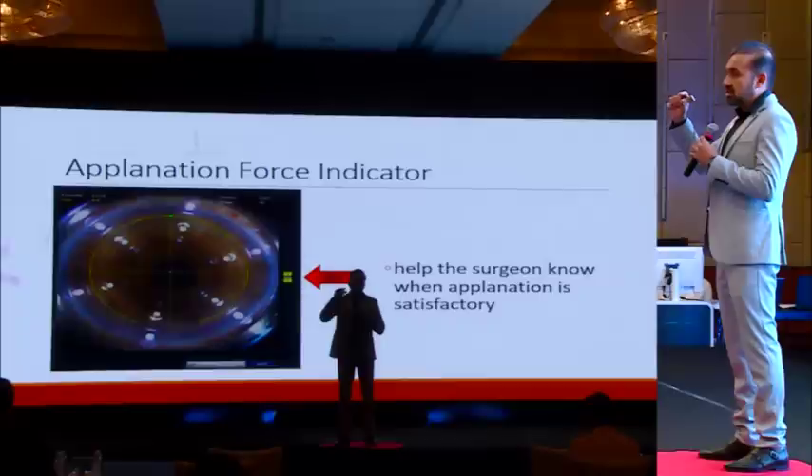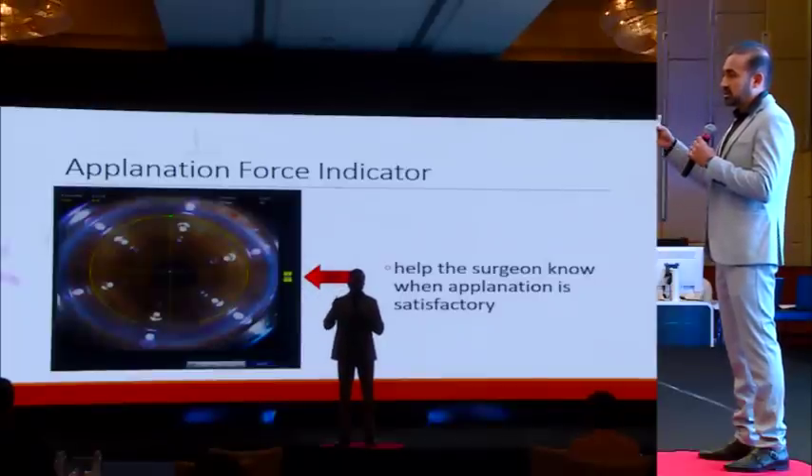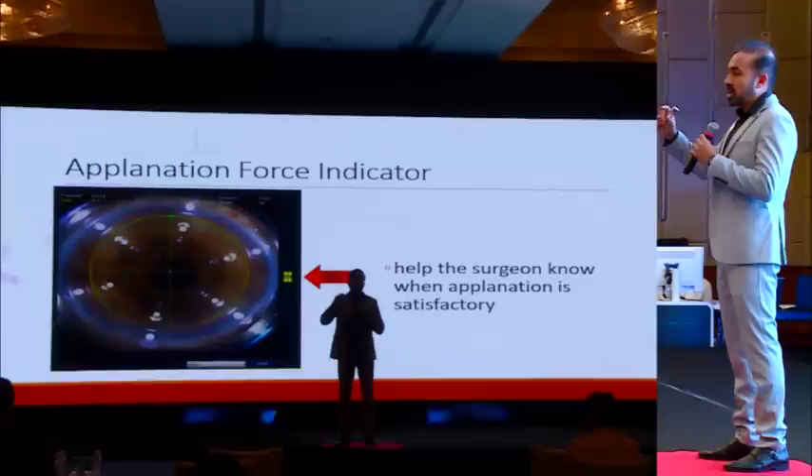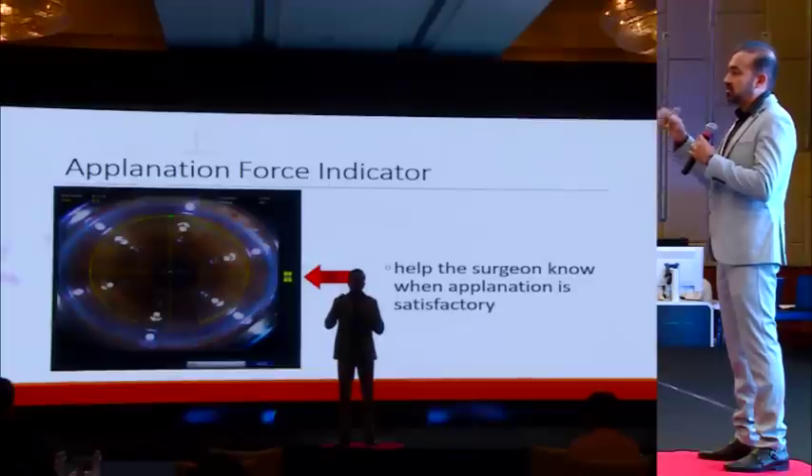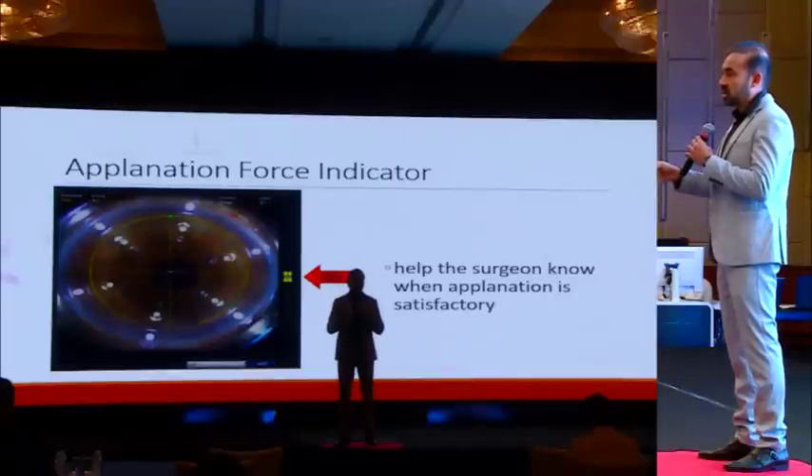On the right side of the screen is the applanation force indicator, which tells you that applanation is perfect. When it is in the yellow zone, you can apply suction; when it moves to the green zone, that is when you apply your laser. So again, you are seeing what you are doing and can confirm that the applanation force is good enough before the most important step of creating the flap.